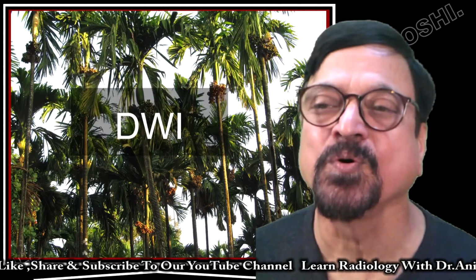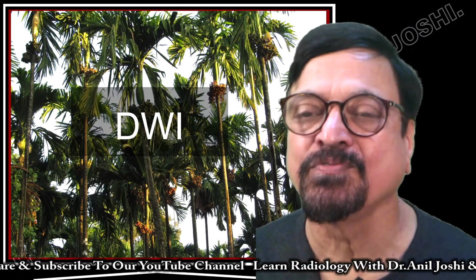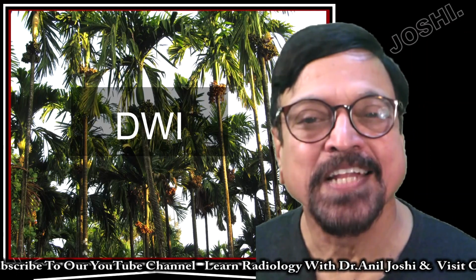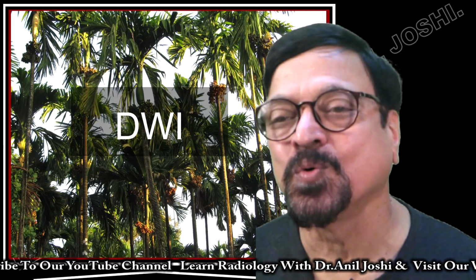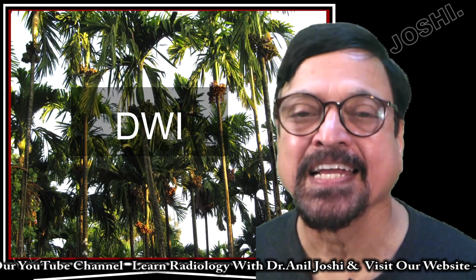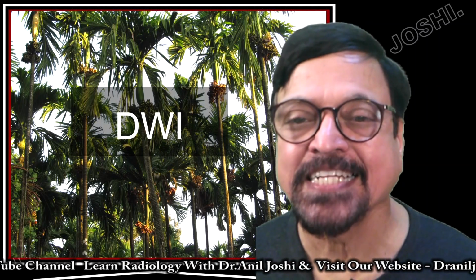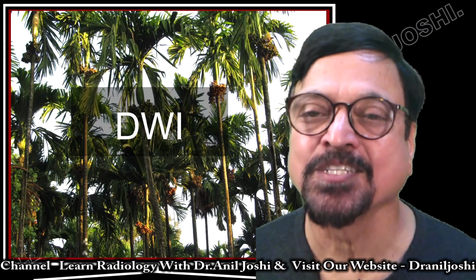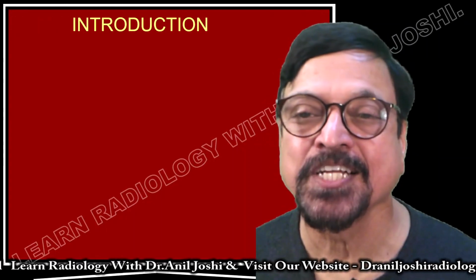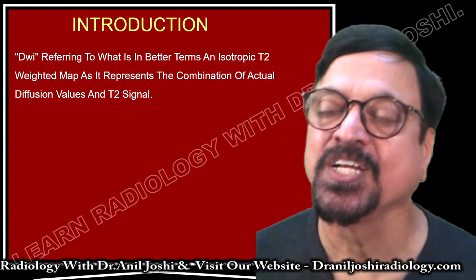Now let's go to DWI, a favorite sequence of stroke. Those who are dealing with stroke, those who want to detect early stroke, those who want the best possible results for thrombolytic agents, for them DWI is the most favorite sequence. Also for a radiologist, because the information it gives in a shorter time is tremendous.